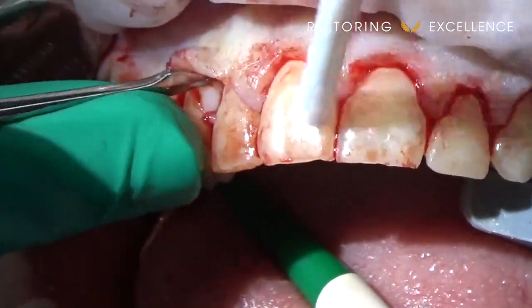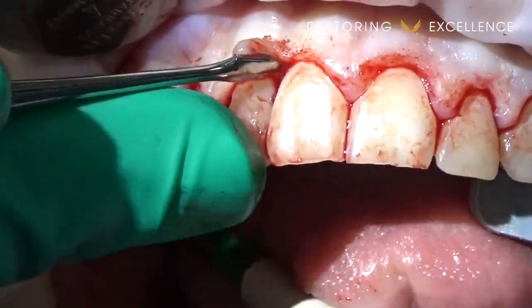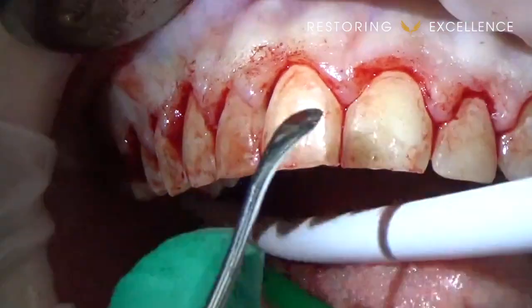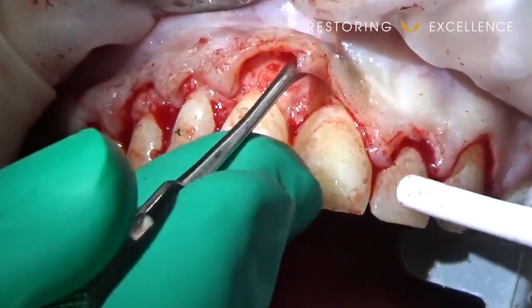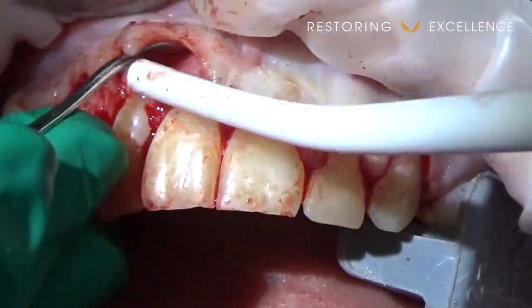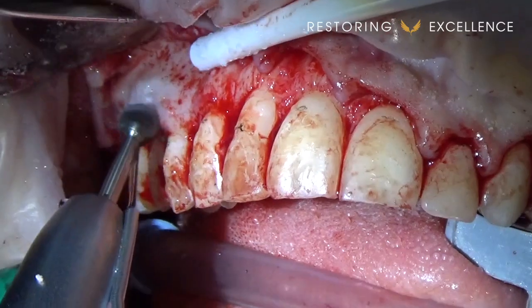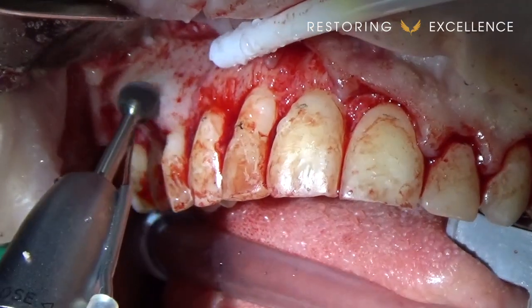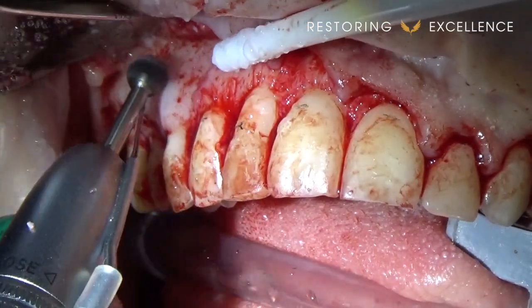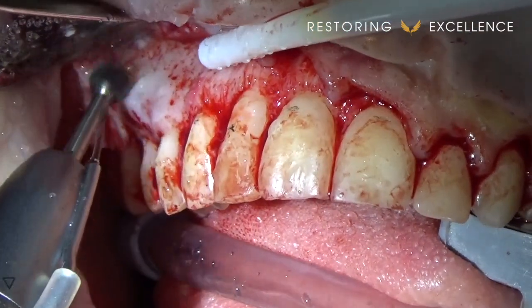As expected — and we knew this from the cone beam — the bone level actually came all the way down to the enamel, so there was nowhere for proper attachment to occur to the root.